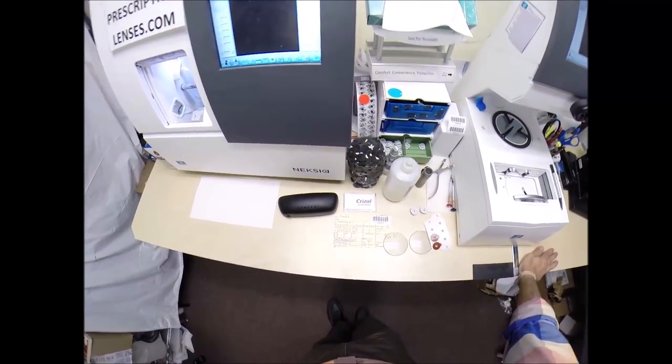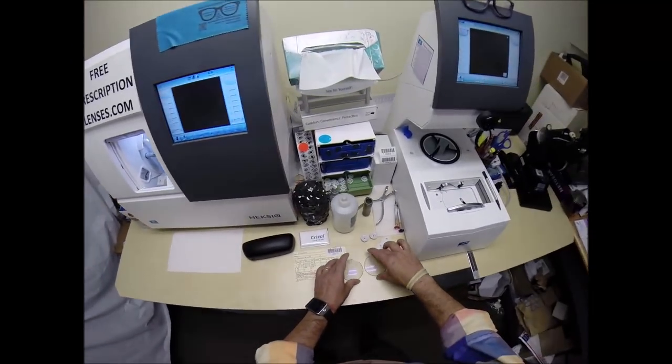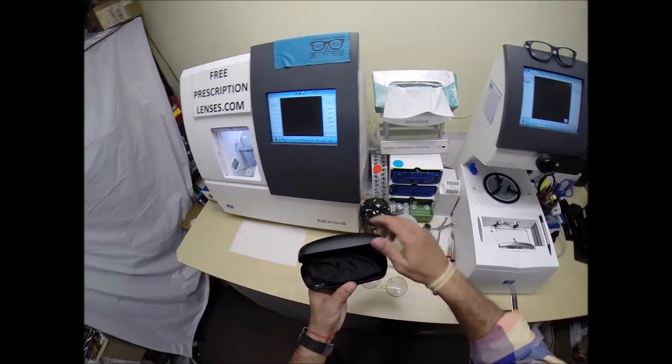Frankie Panky in Syracuse, New York. See more at freeprescriptionlenses.com. Today I'm going to cut your prescription lenses with Transitions Extra Active Gray and Crizal Anti-Glare for your Oakley 8132.